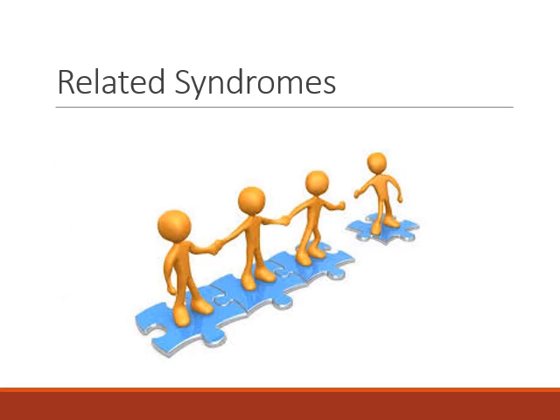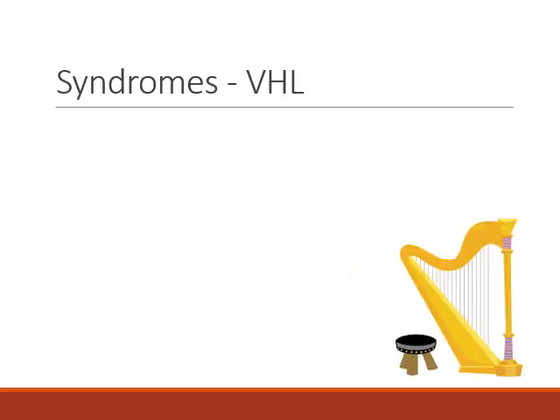That's it. We're done with solid and cystic masses. We're going to end with the 3 syndromes that feature renal masses and are favourites for examiners. And we'll start with von Hippel Lindau.